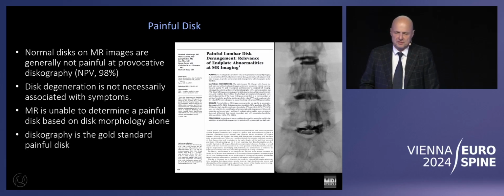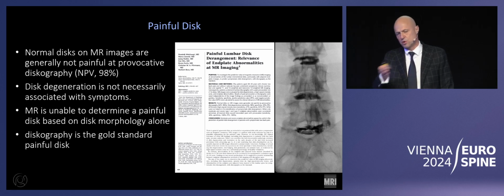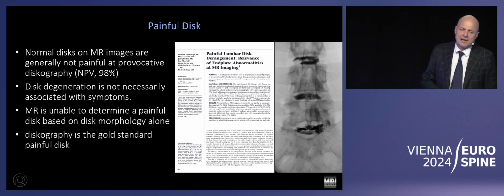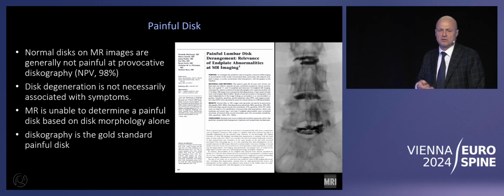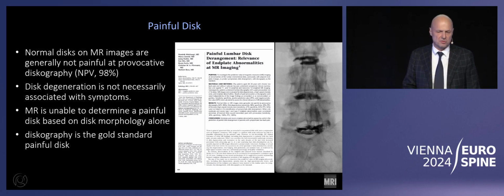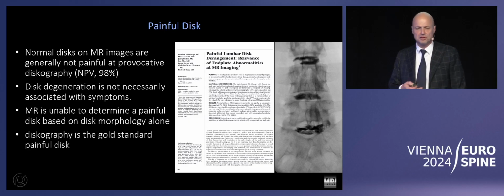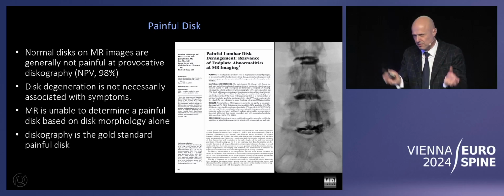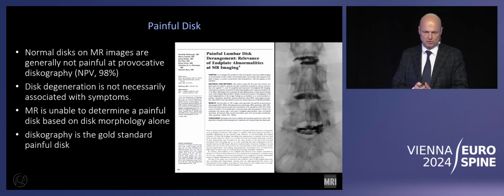How about painful discs? This is a paper we also did at that time. We correlated disc morphology and adjacent findings to provocative discography. Well, at least we could say a normal disc on an MRI is generally not painful. However, advanced disc degeneration is clearly not necessarily associated with symptoms. So MR using just the morphology of the disc is unable to determine a painful disc. That's bad enough.